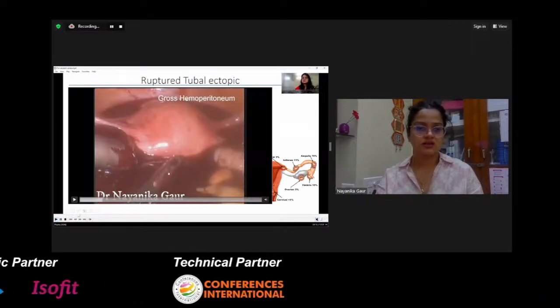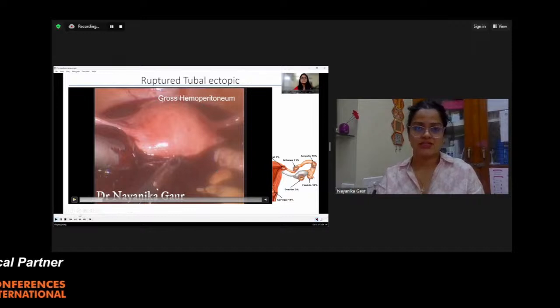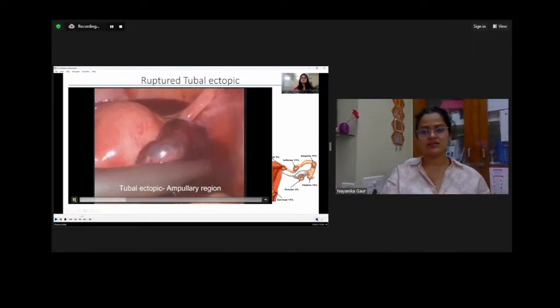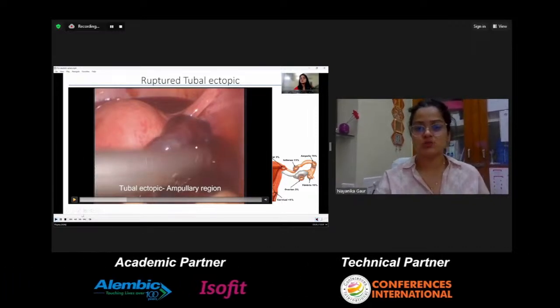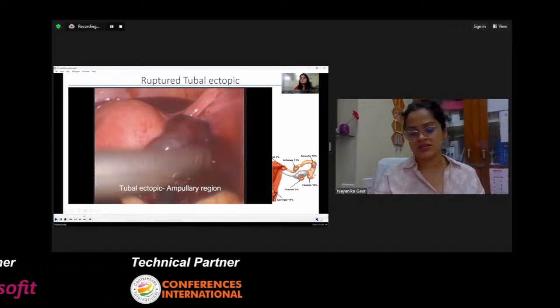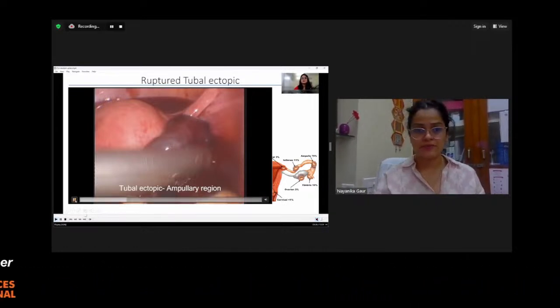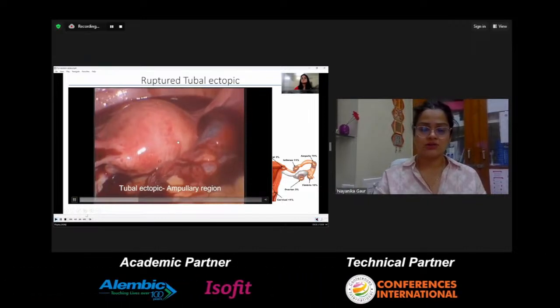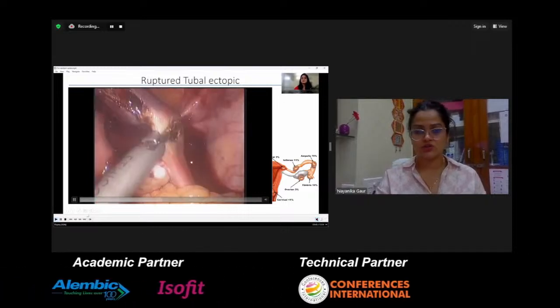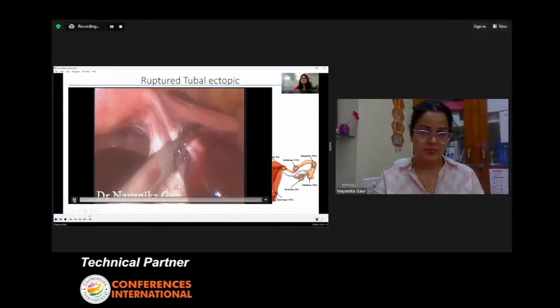So this is the first video, where I will be demonstrating a tubal ruptured ectopic pregnancy. Here you can see that there is gross hemoperitoneum, and there is tubal ectopic tissue in the ampullary region of the tube, as demonstrated by the diagrammatic representation at the corner. As we suctioned out the blood, we could identify the ruptured ectopic part of the tube on the right side, and the treatment remains salpingectomy for these patients.